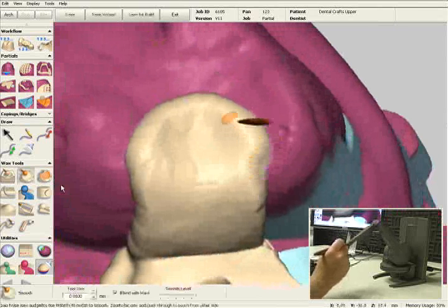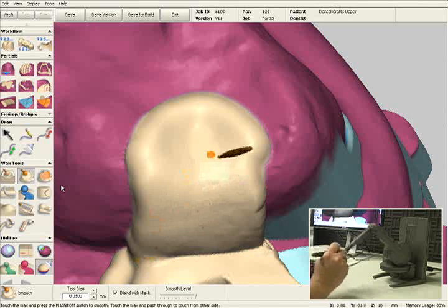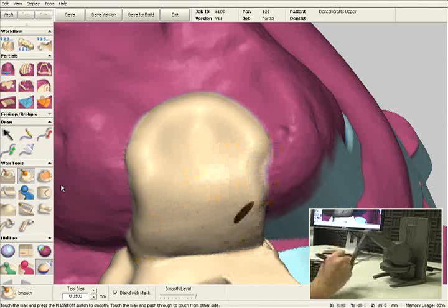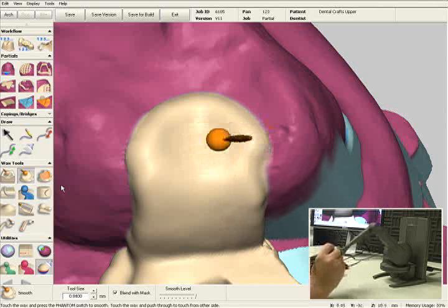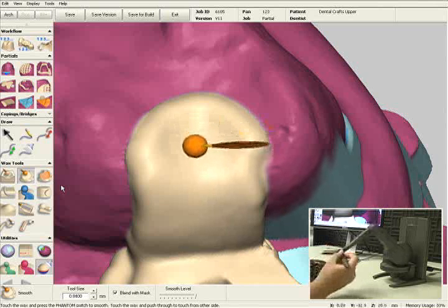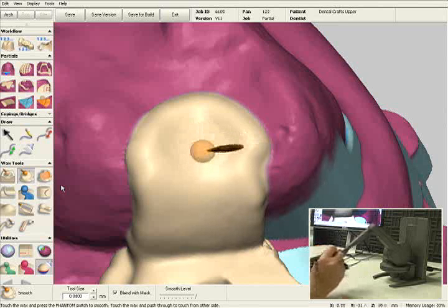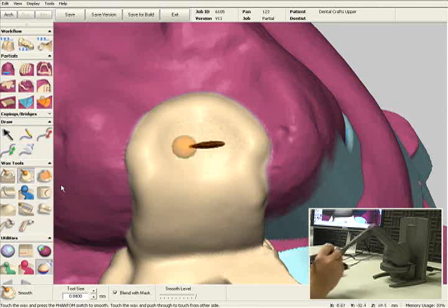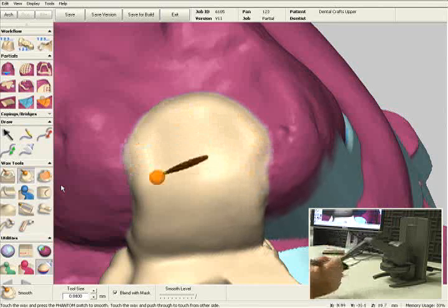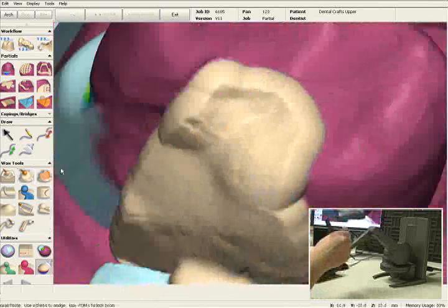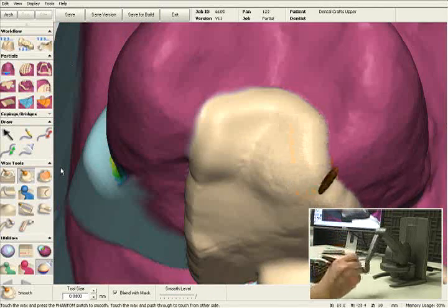I'll do the same thing on the rest seat and the guide plane. Now as I'm using the smooth tool, I'm not removing any wax — so I'm not making this rest seat or guide plane any thinner. What this tool actually does is push wax around wherever I'm touching it, to blend it in, but it's not removing any material. Let's get rid of the sharp corners on number 4 as well.